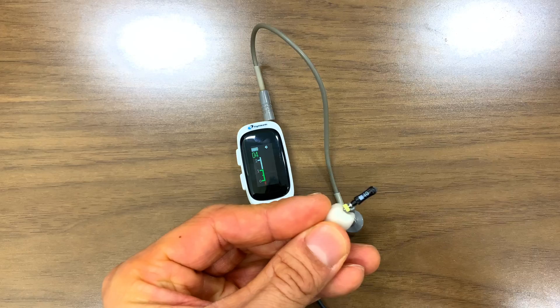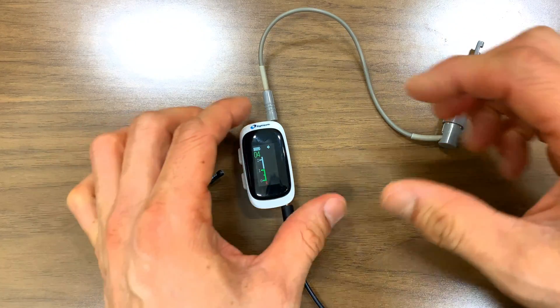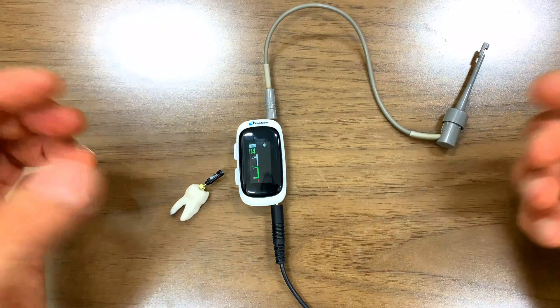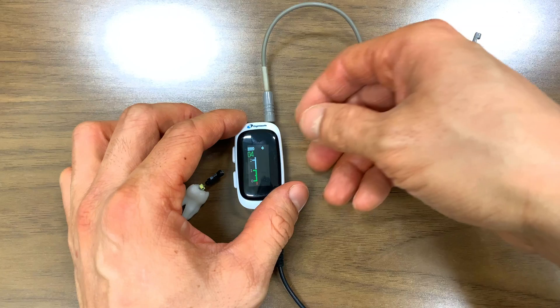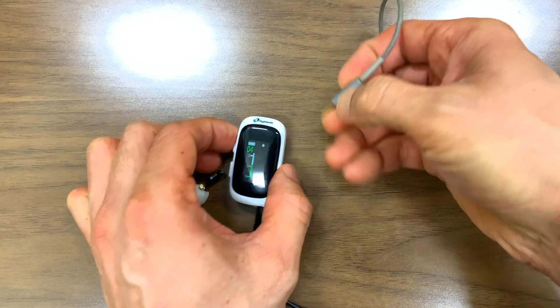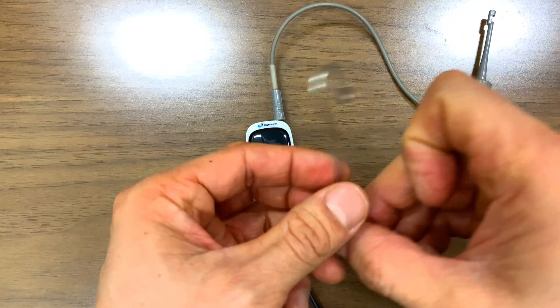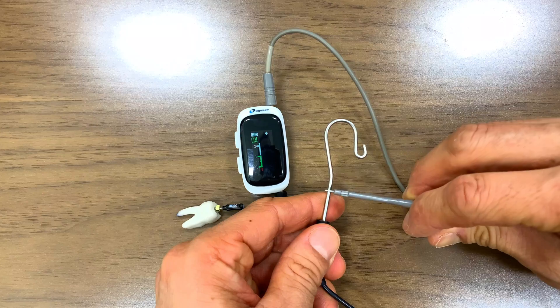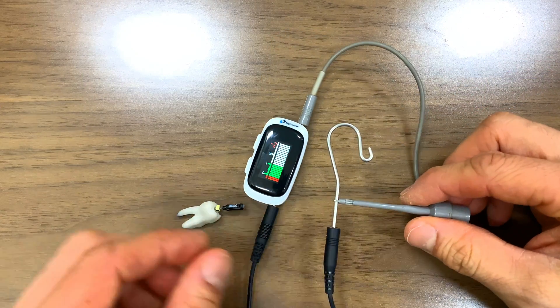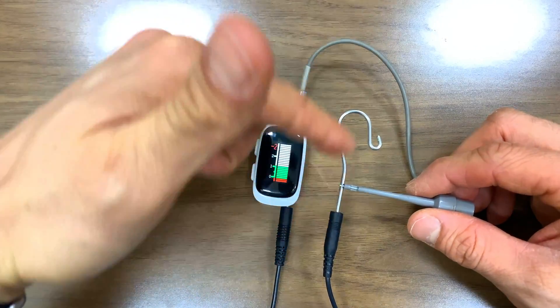You get no reading and you think, what is going on? So you start running around, checking the batteries, checking this and that. One of the simplest things you can do before you start your apex locator is just make sure that you have connectivity with your file holder and your lip clip. It's like flying an airplane — it's just a checklist, making sure there's connectivity between this whole little circuit here.